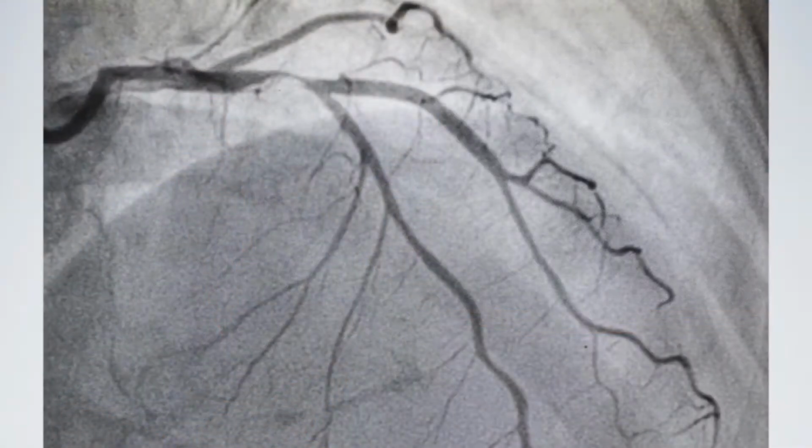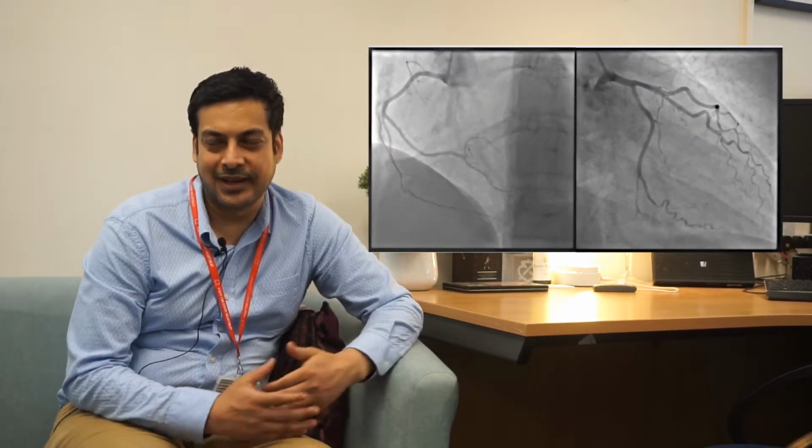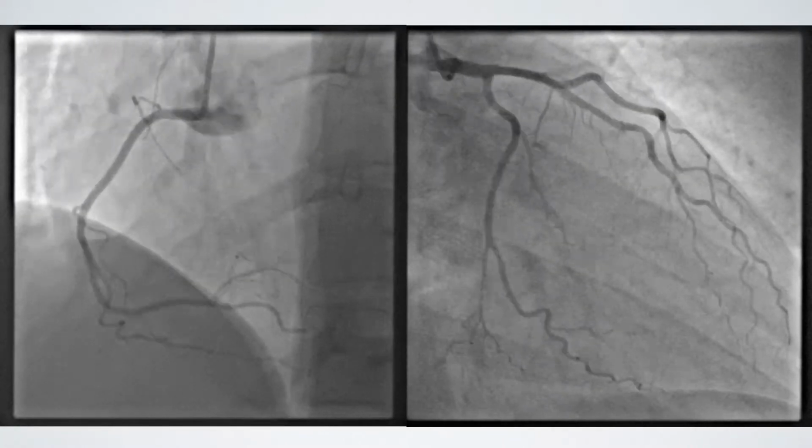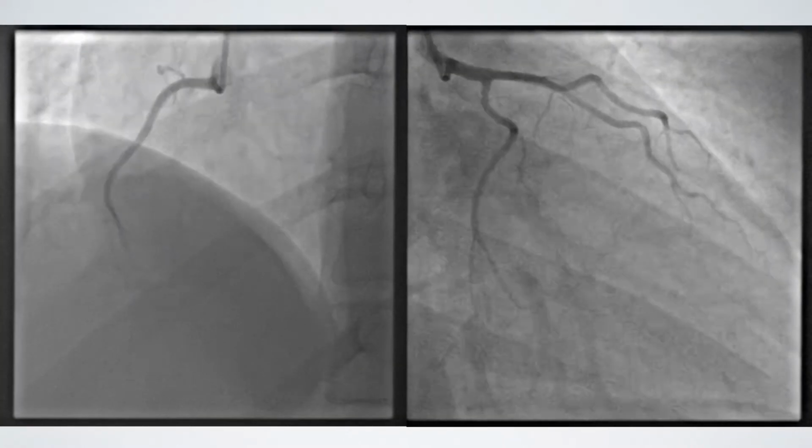For those of you who are not familiar with catheter angiography, we've got a very severe lesion in the middle of this gentleman's left anterior descending artery. When we put the frames together, we produce these cines, and this is what we actually see and use in the cath lab when we're doing it in real life. What you've got is pictures on one side of the left anterior descending and the left circumflex artery, and then on the other side of the right coronary artery.